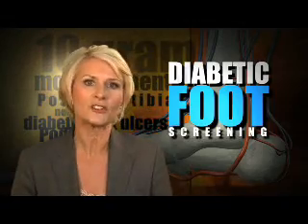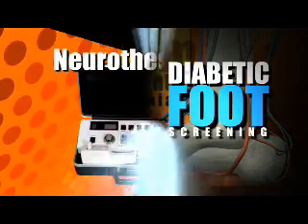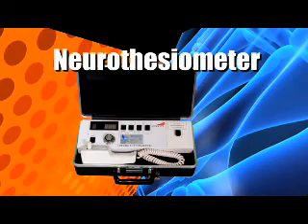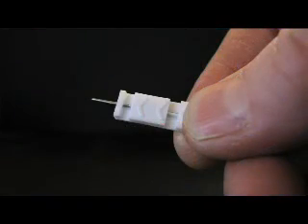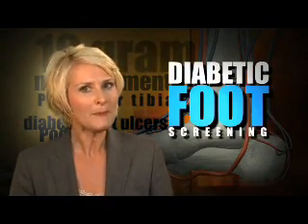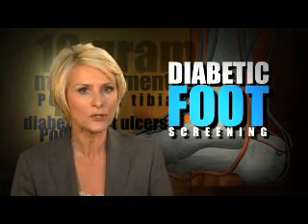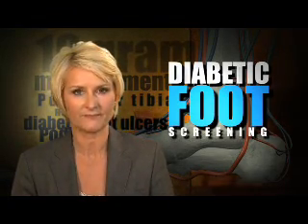There are 2 other tests which can be carried out to test for signs of neuropathy. These can be carried out using a neurothesiometer or a neurotip. It's not necessary to carry out these additional tests during a routine screening, but they may be carried out as part of a more in-depth assessment and can be useful for research purposes.